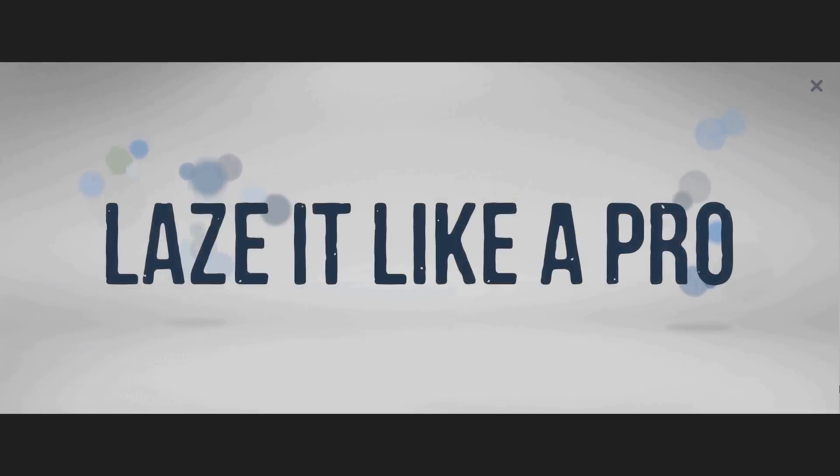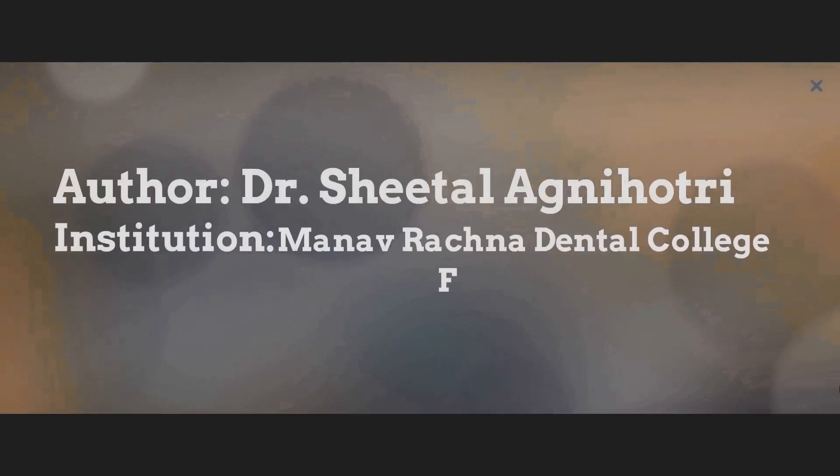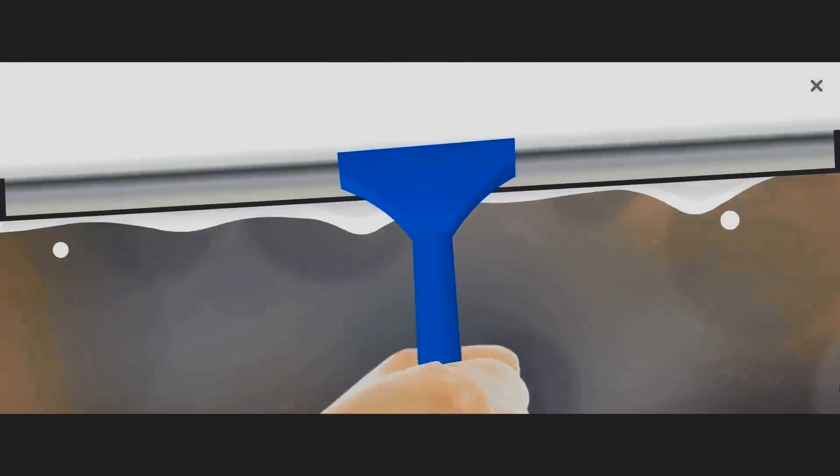Whiter, brighter teeth just in 8 minutes. I, Dr. Sheetal Agnihotri from Manav Rachna Dental College, am here to showcase the use of lasers in bleaching.